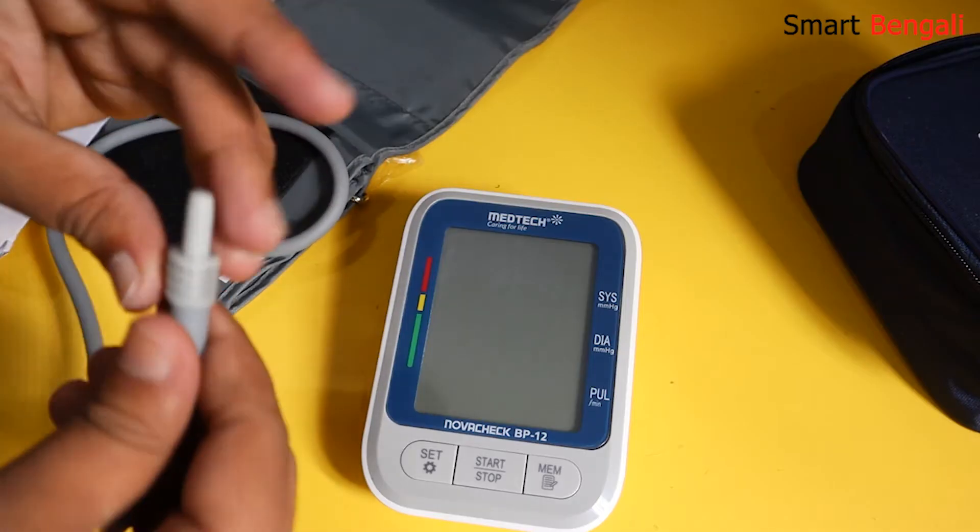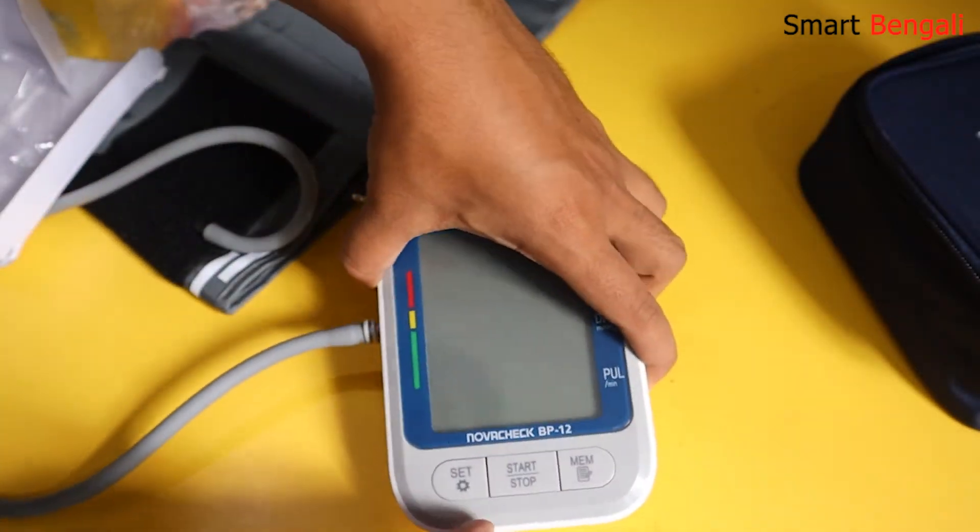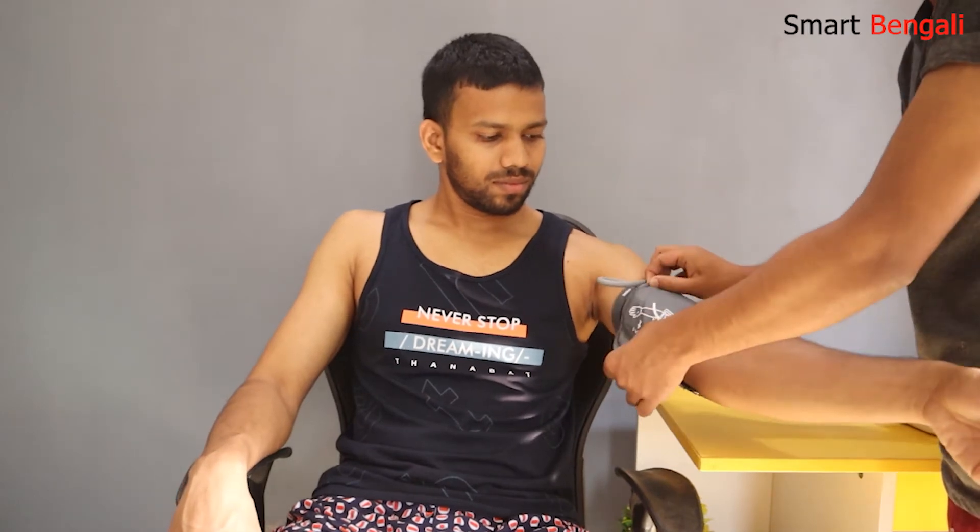Let's test the device and check the accuracy. I'll attach the tube firmly. So here's my friend Sujal — he'll help me with this demo. Sit in a comfortable chair with your back supported, put both feet flat on the ground, and rest your arm at chest height. The cuff position should be just above your elbow — make sure it's snug but not too tight, and it should be against your bare skin, not over clothing. Please do not talk while your blood pressure is being measured. Currently it is monitoring his BP and pulse rate using the oscillometric method — the cuff will first be inflated and then deflated while the pressure inside the cuff is being measured.